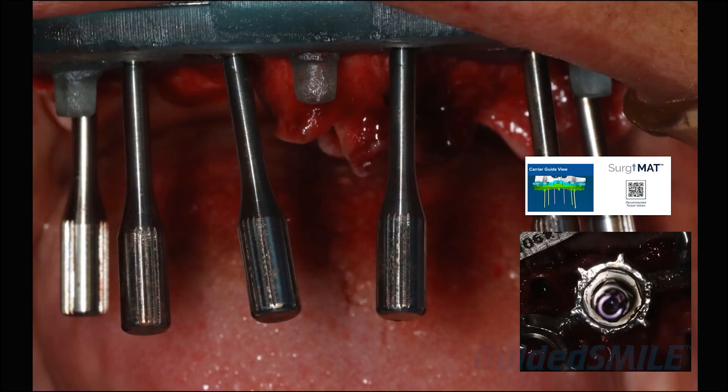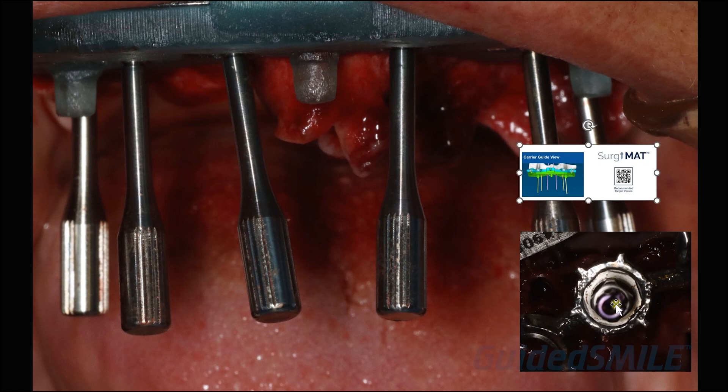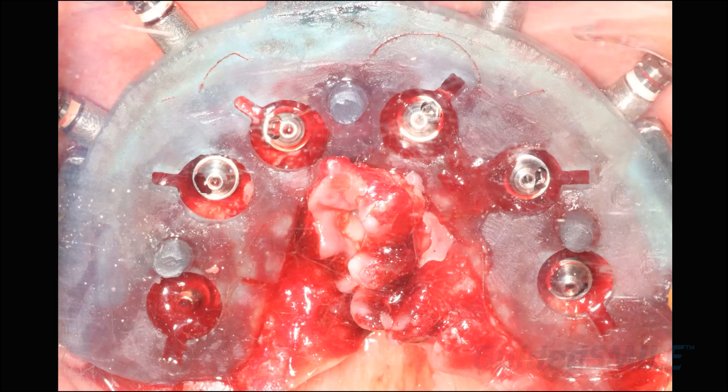The reason indexing is so critical when slowing down at the end is because you will get a temp cylinder that's a little bit out of position. The plan was that they were just about perfectly parallel, but during execution these all look good except this one — I believe the rotation was off just a little bit. That is why this temp cylinder would be rotated, and that will manifest itself in the temp cylinder being off-axis.